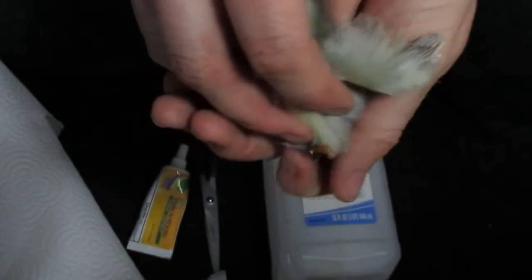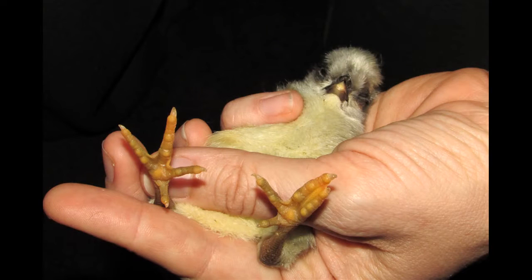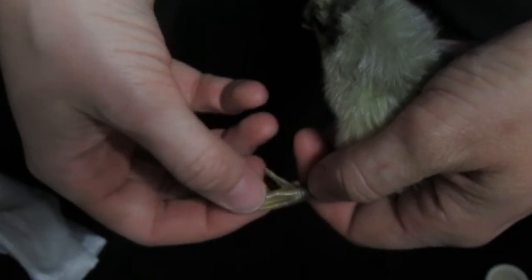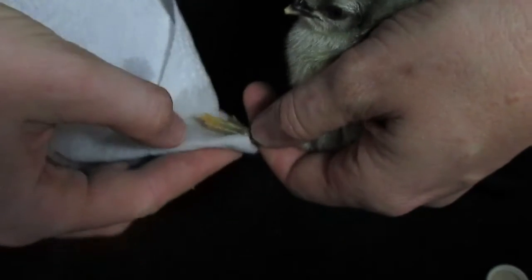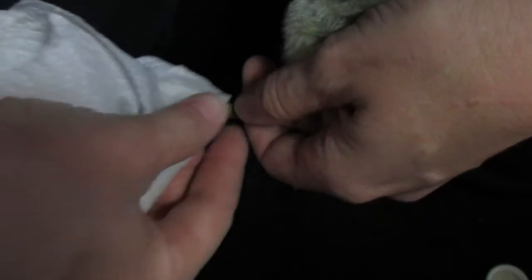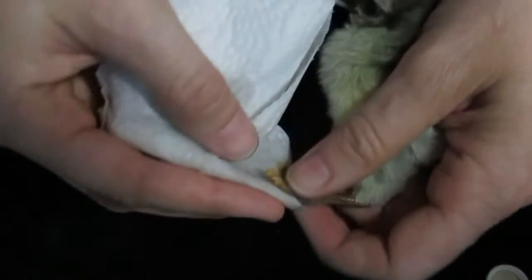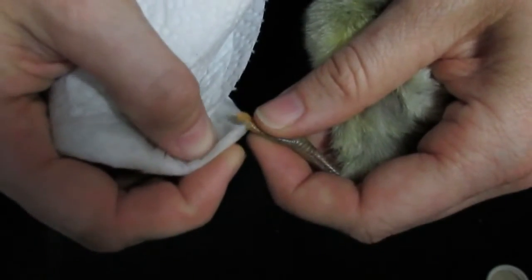So here you go — get a good look. Get a little foot out here. This guy's probably going to squeak. I'm sure that it's not going to feel great, me cutting into its skin, but this is a procedure that is going to help this chicken live a much better life when it gets older. And since it's so young, it won't have to worry about its toes setting in this sort of curved position. So I'm going to get this really clean — try to keep it in frame for you at the same time. Get under those toenails.